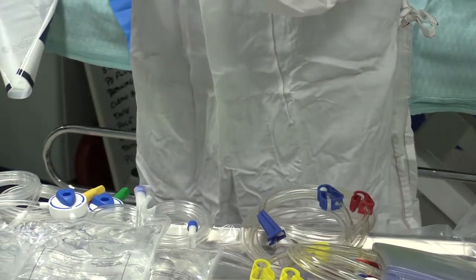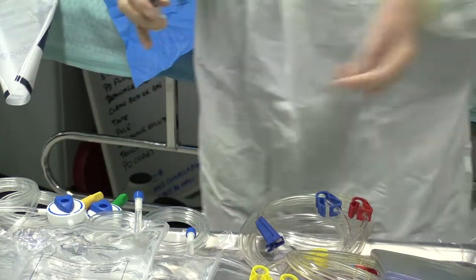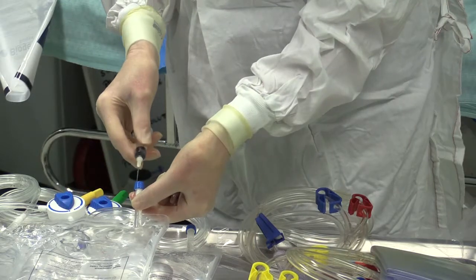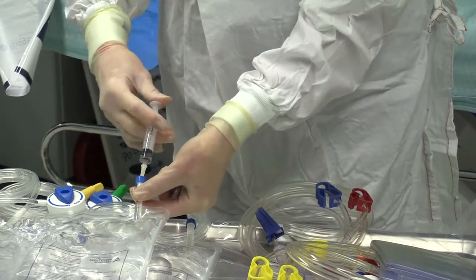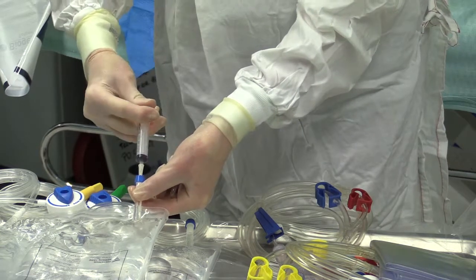And repeating with the second bag. So 1 ml of heparin into the 1.5% solution. Once again, draw back, clearing the port.